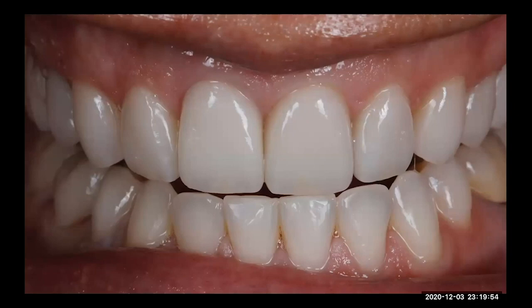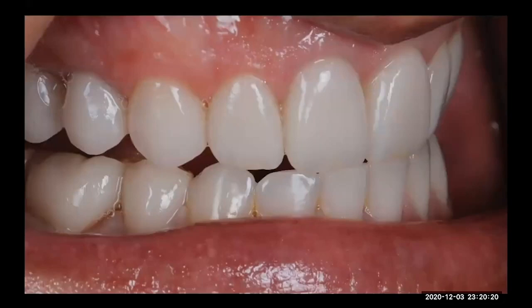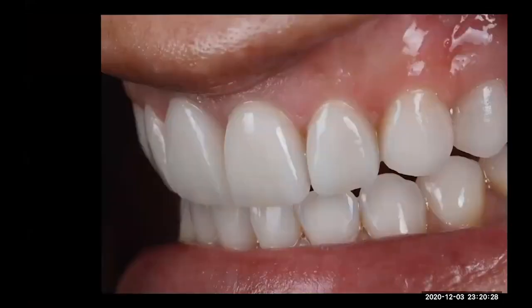But the beauty of this case is we have some vitality in the incisal edge, and we have the value control. You can see that this is a 1-in-1 BL4 color, and still we have a nice value control, but we have some vitality in the incisal edge. That is the idea of a scoop, to create some three-dimensional movement in that part of the restoration. You can see here too the nice integration in the soft tissue that is really important too. Okay, you can see the vitality of the restorations.